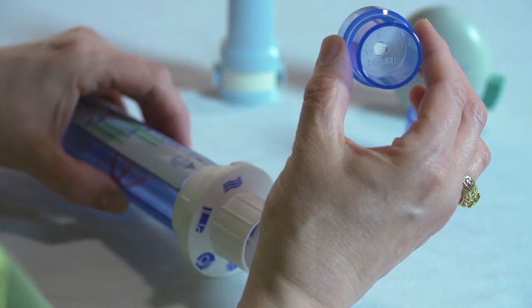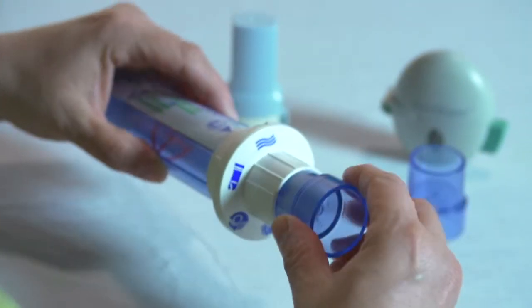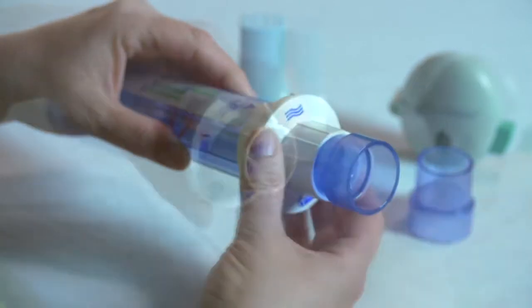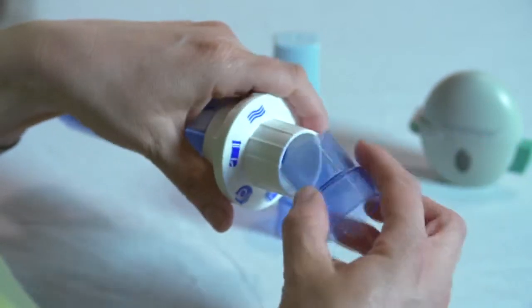For other DPIs, an adapter is needed. Adapters are available for the Aerolizer, Handihaler, and Twisthaler. The Aerolizer adapter is labeled with an F and has a larger opening, and the Handihaler adapter is labeled with an HH and has a smaller opening. The Twisthaler adapter is labeled with a THX.